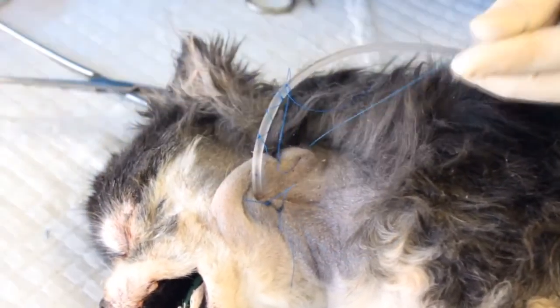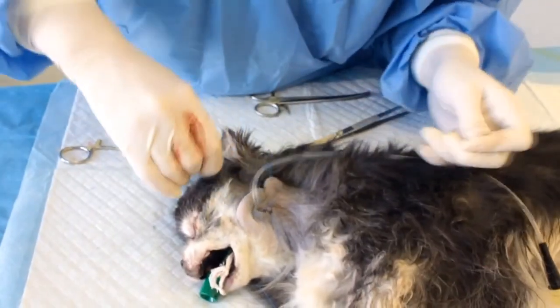Another anchoring suture can be placed to further secure your tube into the animal.